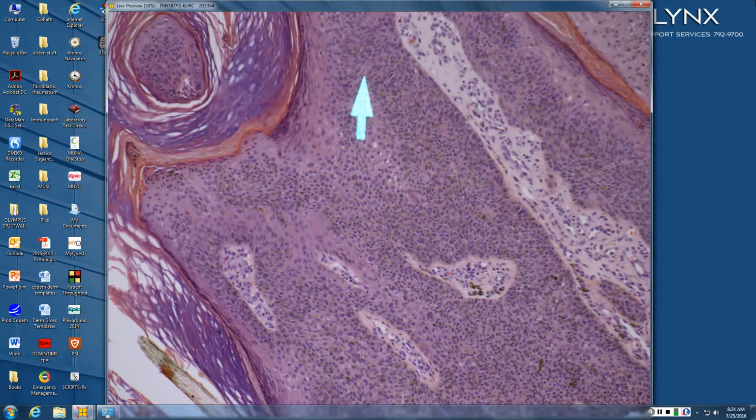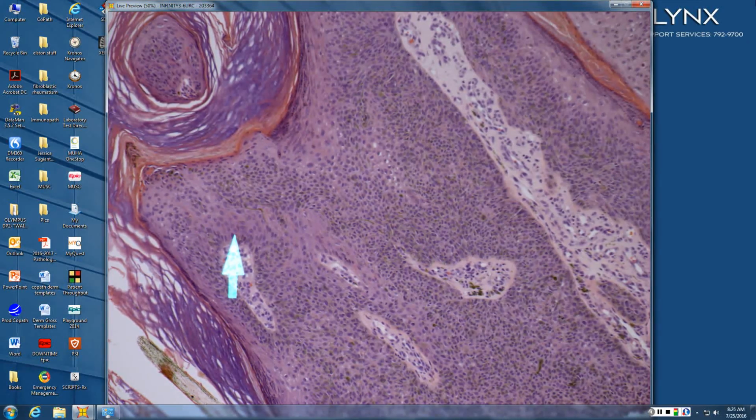So an irritated melanoacanthoma. And is it uniform, or is it little clones embedded in normal epidermis with larger keratinocytes? I'll take the latter. So this, you are telling me, is an irritated clonal melanoacanthoma. Yes, you're correct, sir.